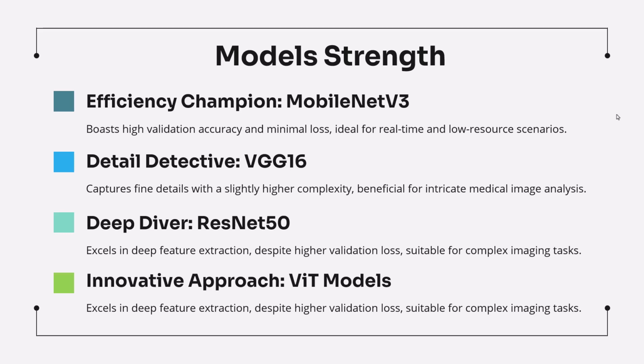The detail detective was VGG16. It captured fine details with slightly higher complexity. It's beneficial for intricate medical image analysis. Our deep diver is ResNet 50. It excelled in deep feature extraction despite higher validation loss. It's suitable for complex imaging tasks.